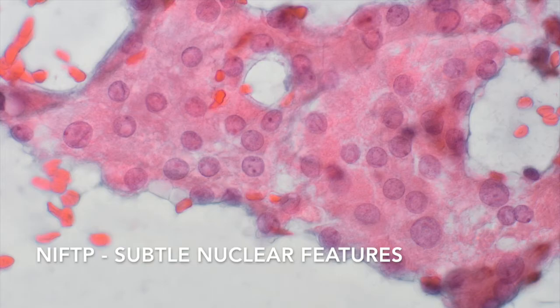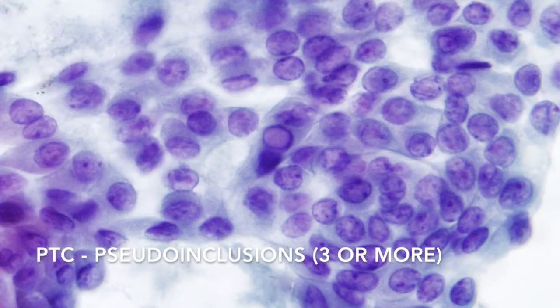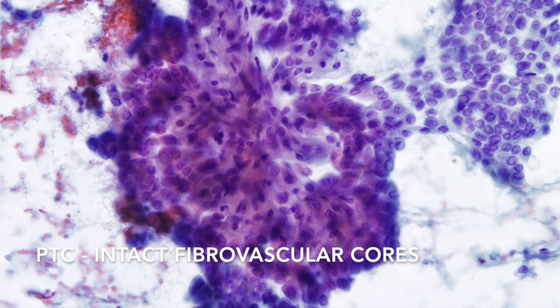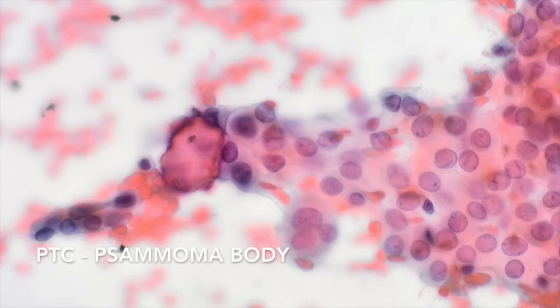Some features that allow a definitive interpretation of papillary carcinoma are multiple — typically more than three — pseudo-inclusions, of which we can see one example here; true papillae with intact fibrovascular cores; and psammoma bodies — all these in the setting of other nuclear features of papillary carcinoma.